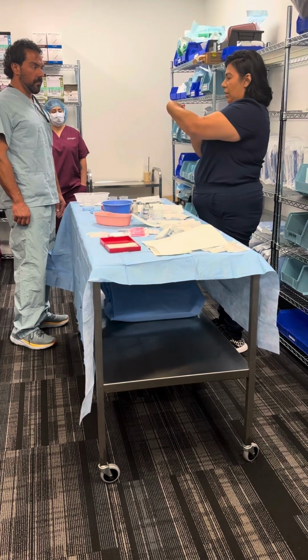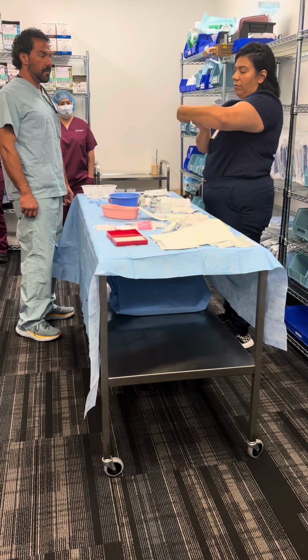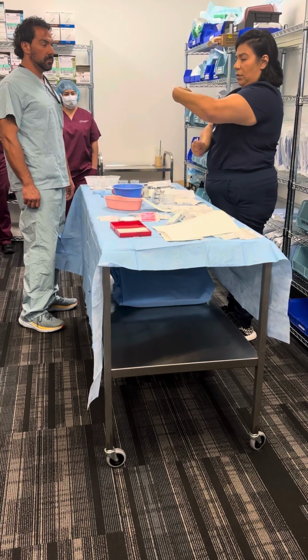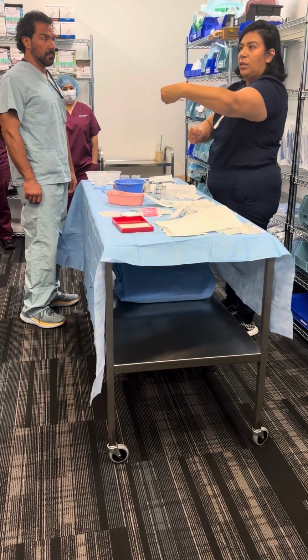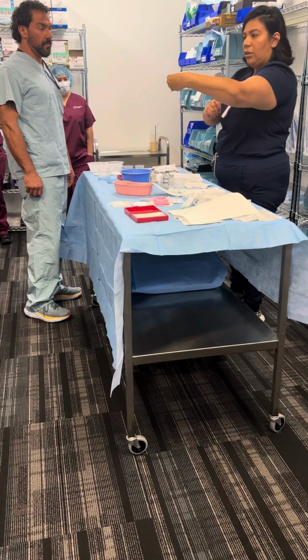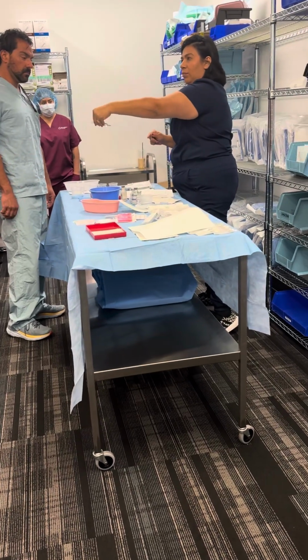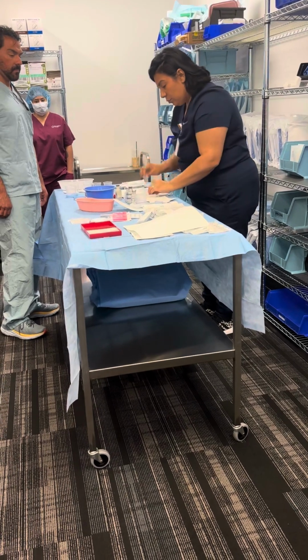Okay, I got 1% lidocaine. They do it opposite. They do it this way, but now they have to do this, which is awkward, right? They do this. Look at how close that is to me. Okay? Don't be that person. Don't stab yourself. This is awkward because it points at me, where if I do it with my right hand, it's not going to be pointed towards me.